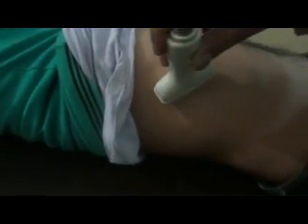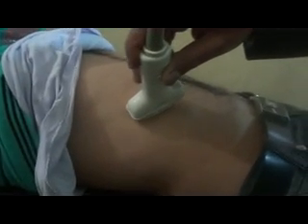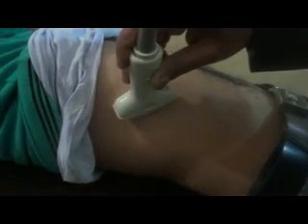This is the anterior wall of the gallbladder, this is the fundus of the gallbladder, this is the posterior wall of the gallbladder, this is the neck of the gallbladder, and this is the body of the gallbladder.